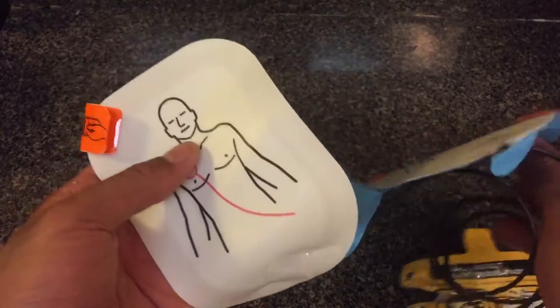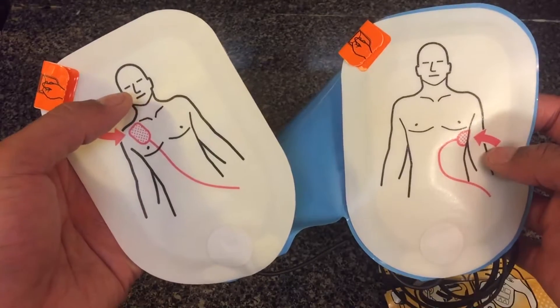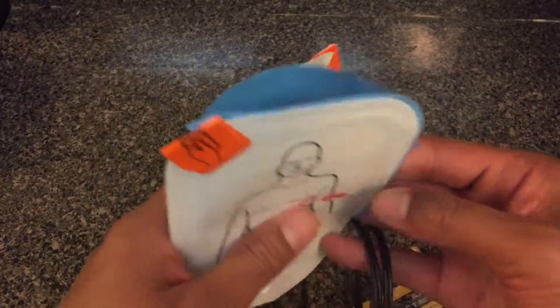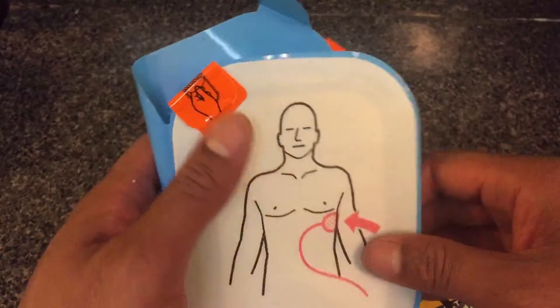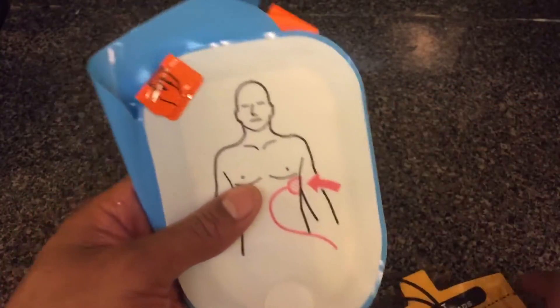You're going to do the same thing with the other pad and place it in the right area to deliver the jolt. That's the defibrillator pad. If you have any questions, please let me know — check the description below for more information.